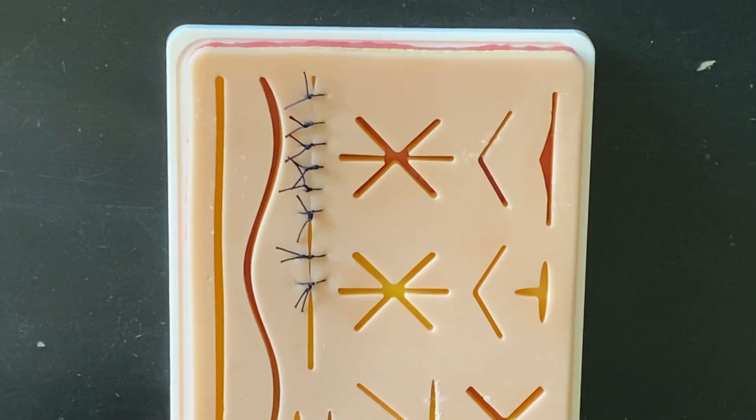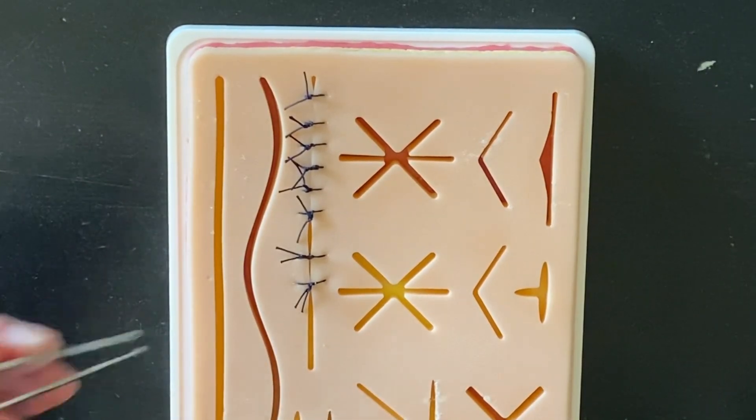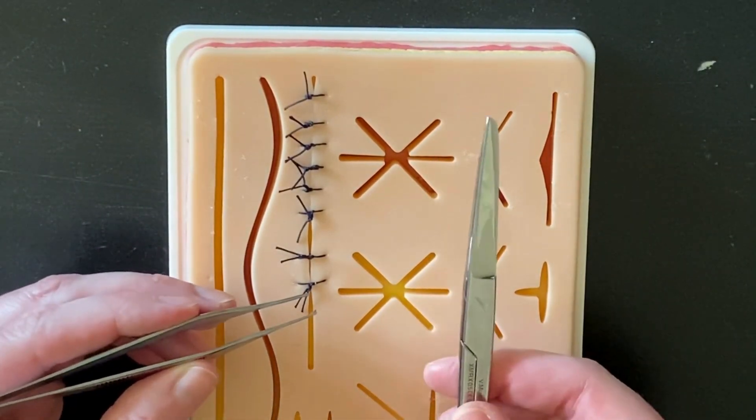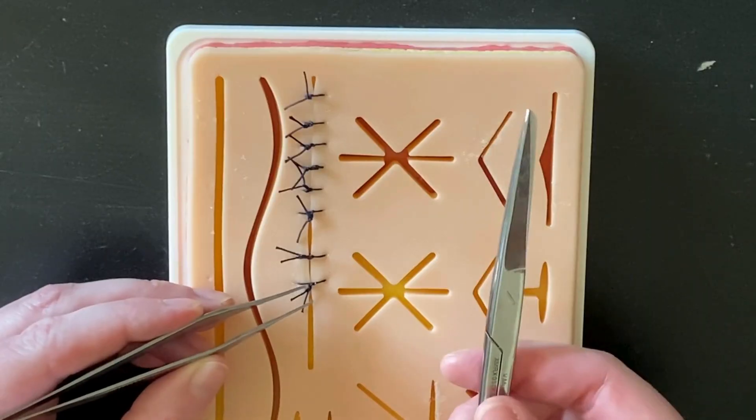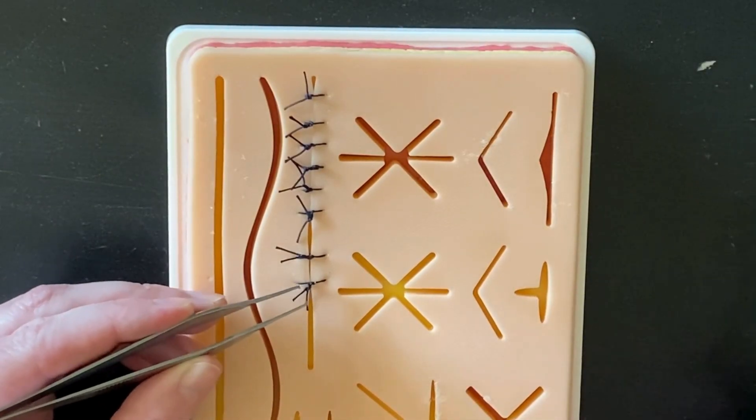Another lesson in removing sutures. Typically we're going to use an Adson and suture scissors to remove sutures. You might use an iris scissors if they're very fine sutures.